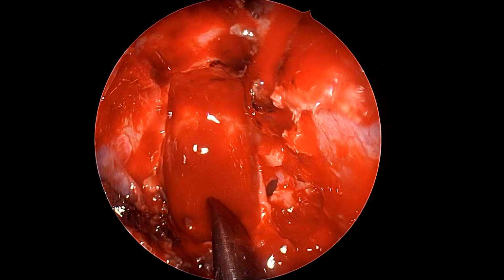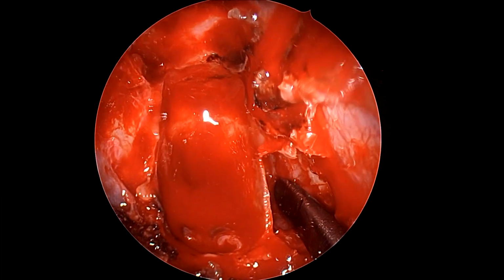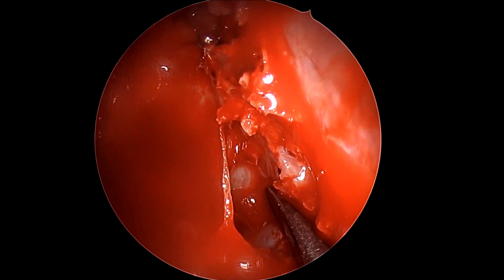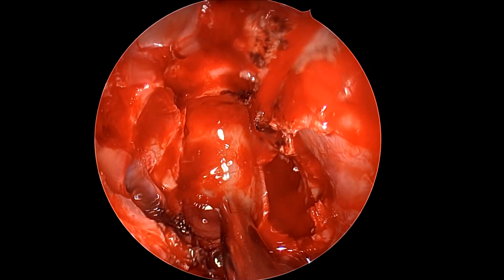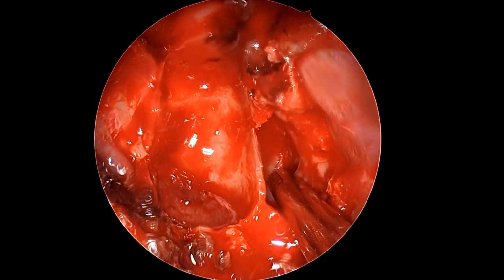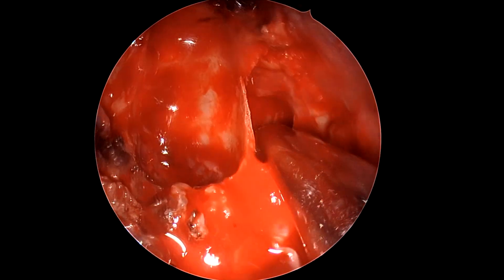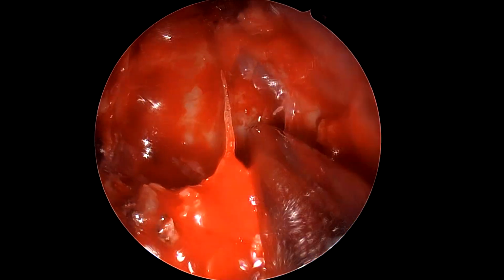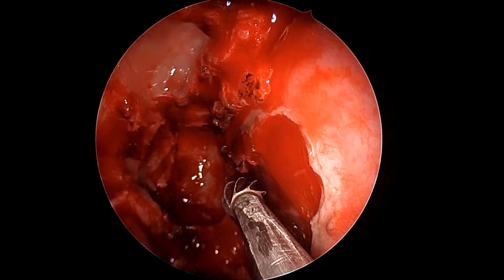You see here how we have come to the planum. The sphenoid face on the right side is nearly completely exposed along the complete height from the floor to the roof of the sphenoid sinus. You see on the right side there is a huge bulge. That bulge itself is the sellar bulge caused by the tumor. Now we are using a shaver blade to just ablate and eat up the intrasphenoid mucosa on the left side. We are not resecting the septal flap, mind you, and one must be cautious not to do so.